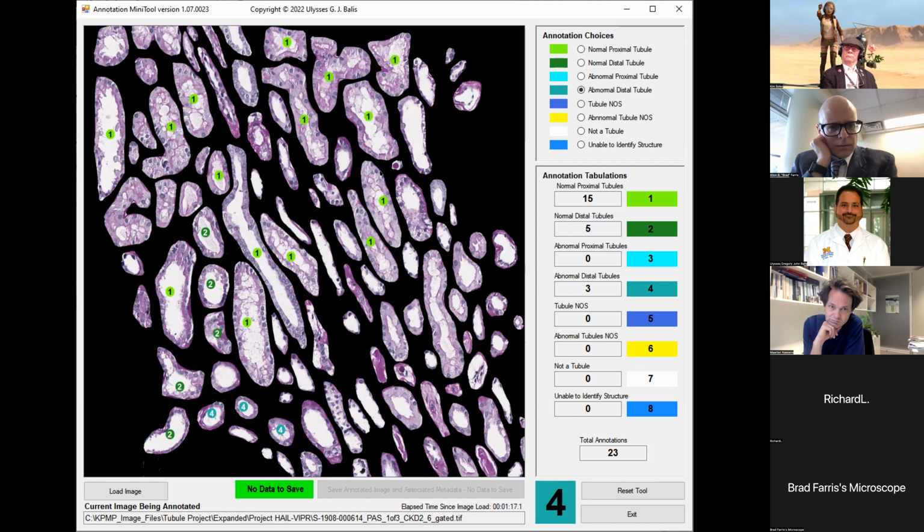So this is an example of building a tool to the need as opposed to having the tool be force fit on a group. And I think there are many cases where lightweight tools like these don't exist and should exist, just to speed up workflow. So it's a very mundane tool, but it allows for a very specific type of activity. And you can label things that you don't know what they are.